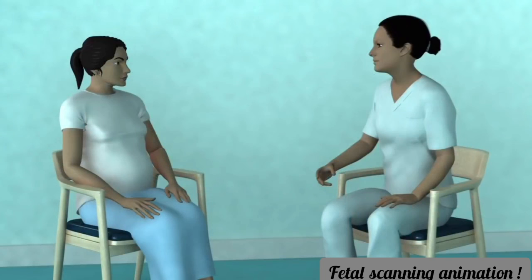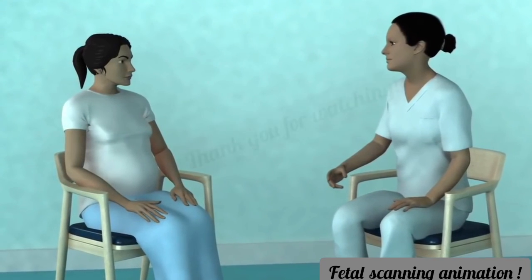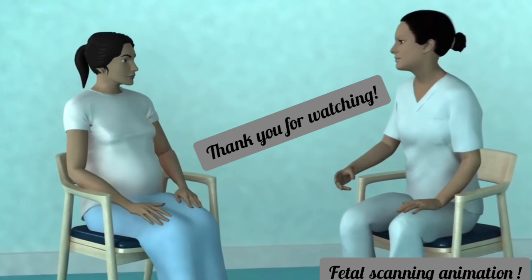The woman is now free to leave, so you can clear her information from the screen by ending the examination and prepare for the next scan.